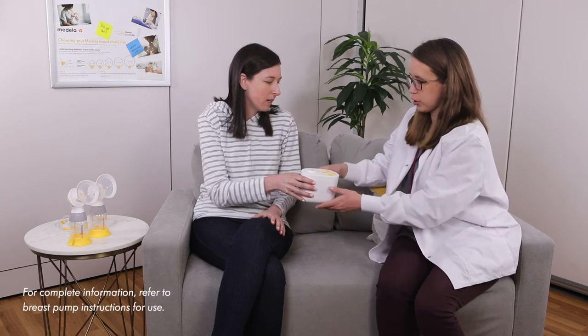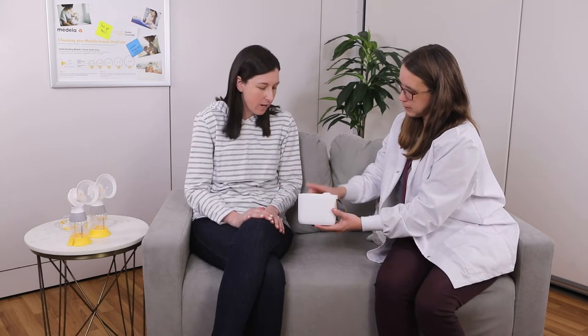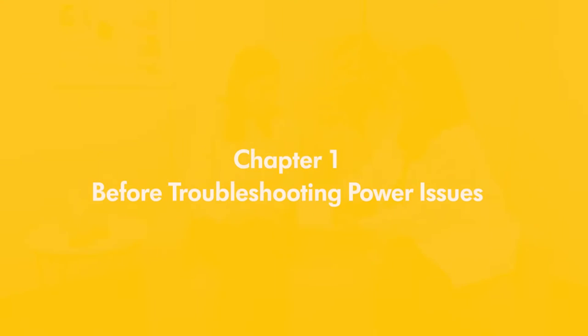This video is designed to help lactation professionals when working with a mom that is experiencing power issues with her Pump and Style with Max Flow breast pump. Before troubleshooting Pump and Style with Max Flow power issues, there are a few steps to follow.